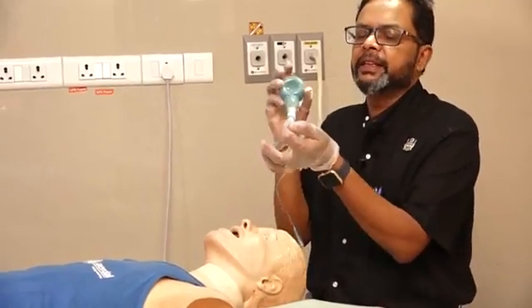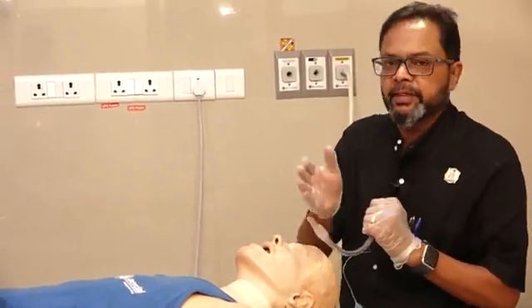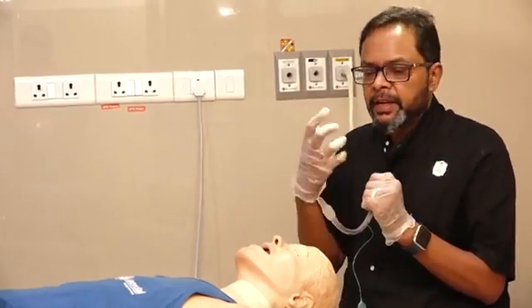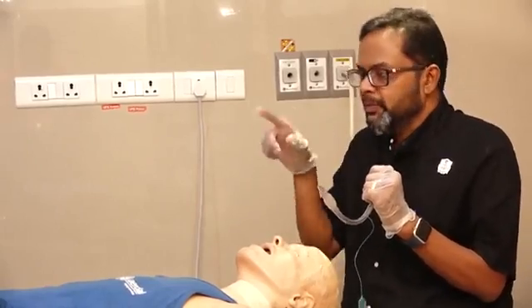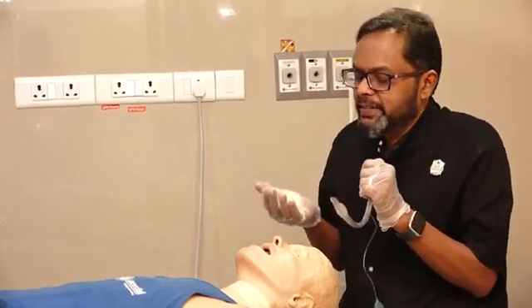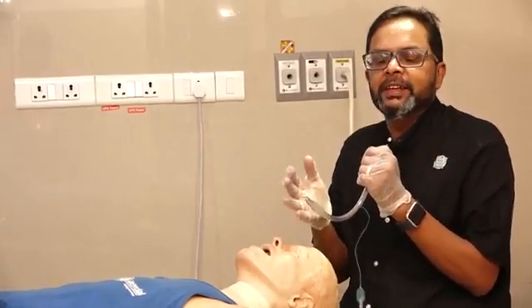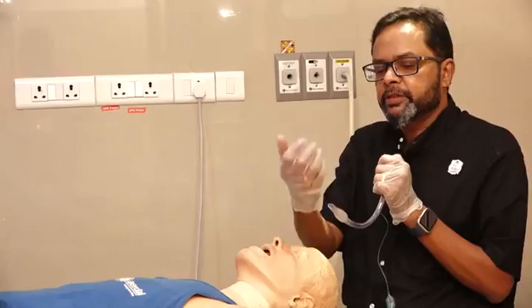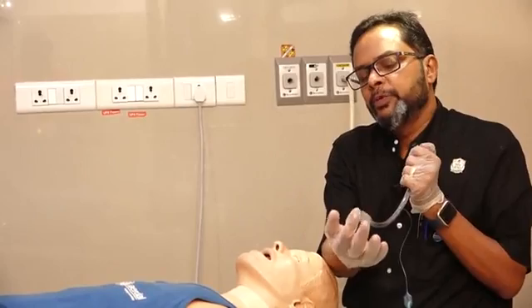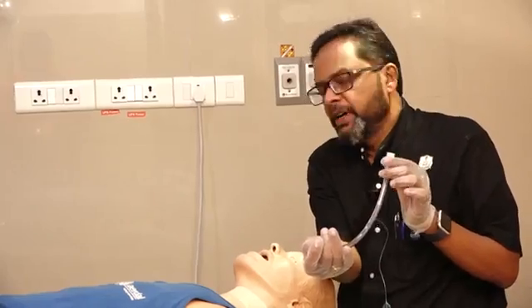This works because of the anatomical difference between the trachea and the esophagus. The trachea is protected by tracheal rings and will never collapse. But the esophagus is a muscular structure, and if you apply a negative pressure, it will collapse. When it collapses, the esophageal mucosa comes and occludes the opening, which prevents the reinflation of the EDD.